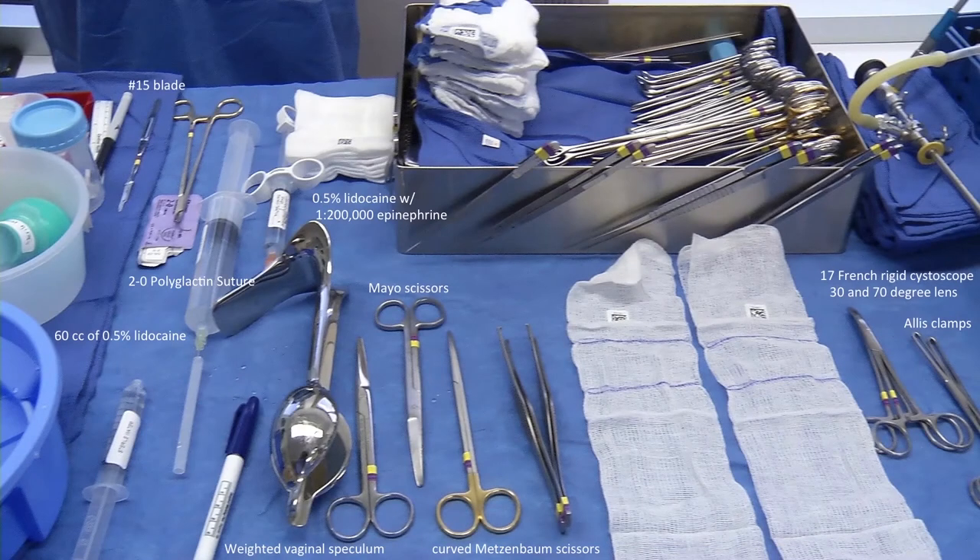Instruments required for a mid-urethral sling placement include a rigid cystoscope with a 17 French sheath and 30 and 70 degree lens, a weighted vaginal speculum, Allis clamps, curved Metzenbaum and straight Mayo scissors, and a 15 blade.